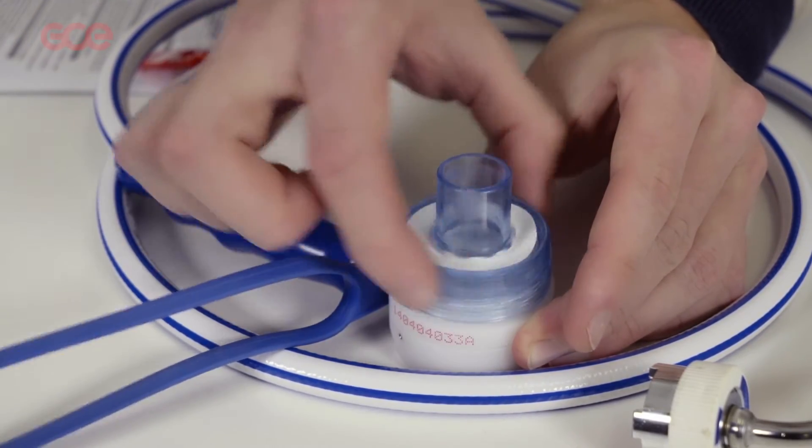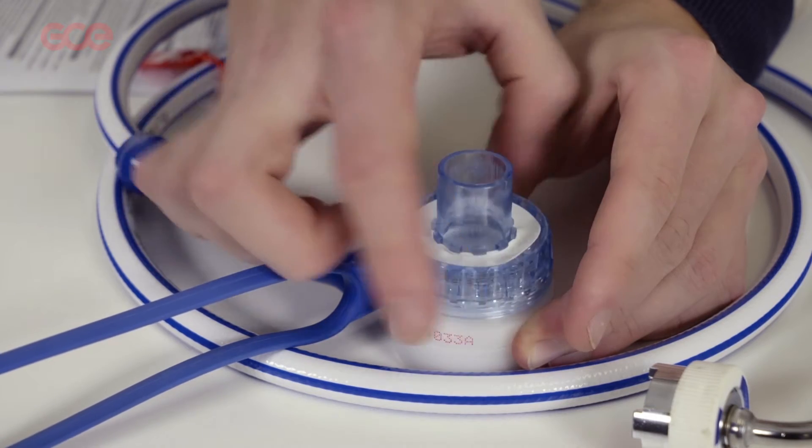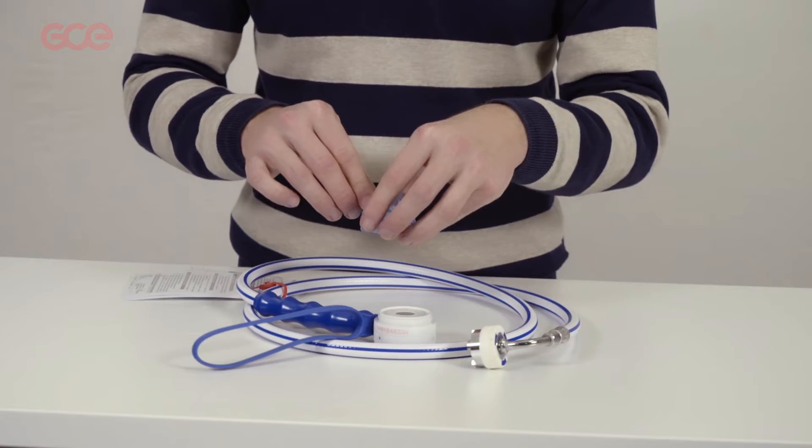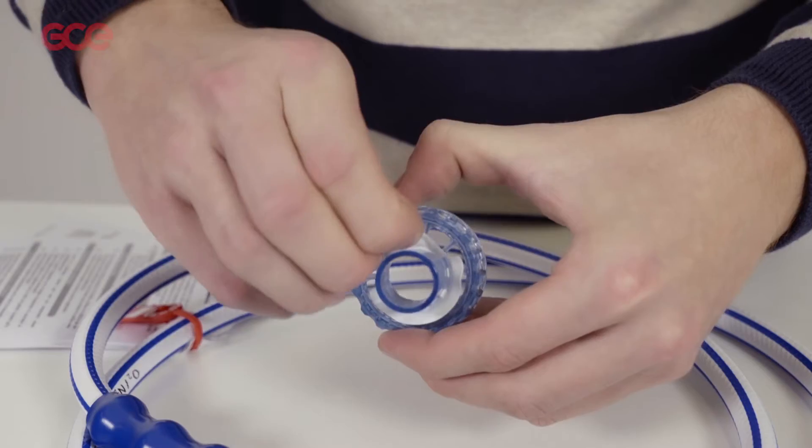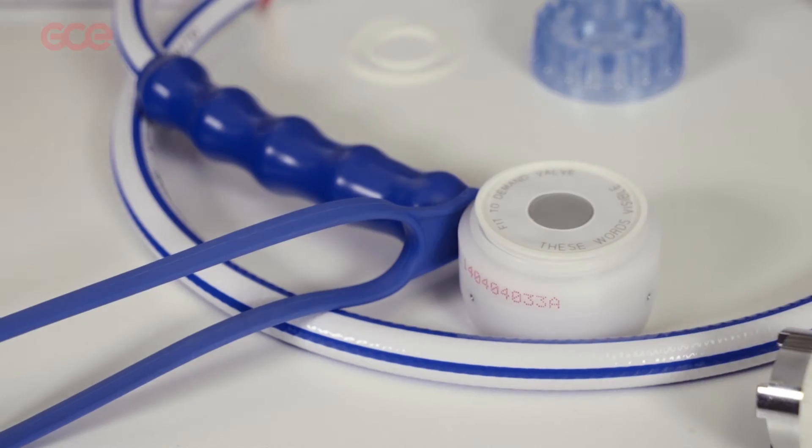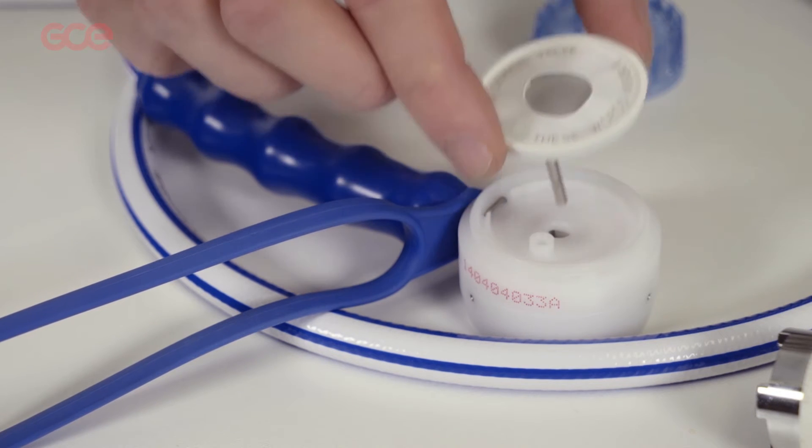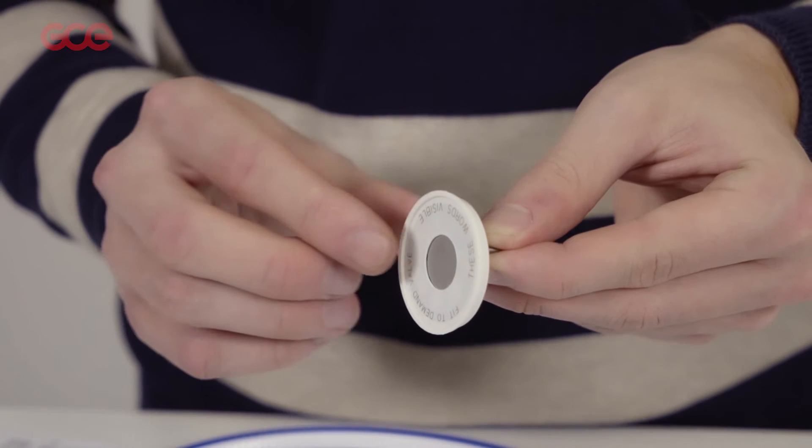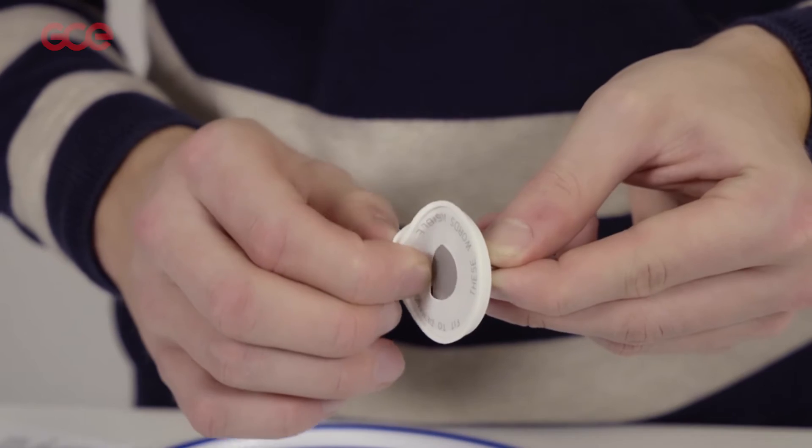Unscrew the blue part from the demand valve. Remove the silicon valve flaps from the patient port and inhale disc. During removal, please handle the pieces with care so as not to damage these parts.